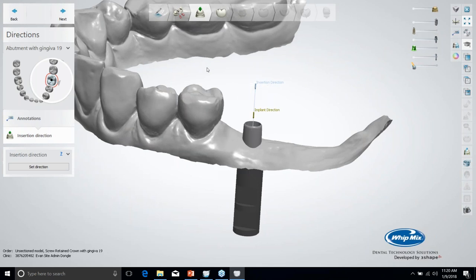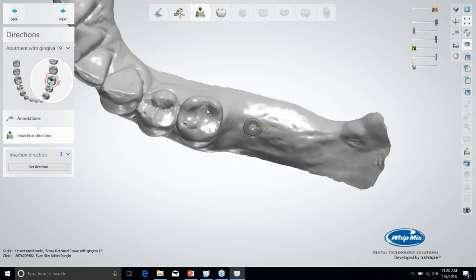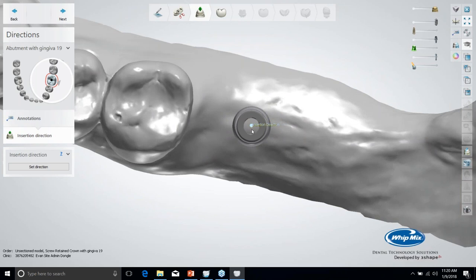On the direction stage, all you're doing is specifying the insertion direction, which is pretty much determined by the position of the analog, so you don't really have to do anything here. Just click next.